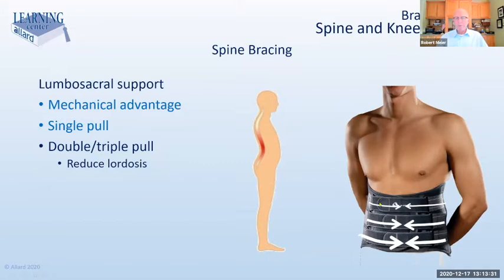Some of these have two pulls, and these are usually non-elastic straps that are pulled real tight. So some of these versions have two pulls. This one that is shown in this picture has three. By the way, I did sign a release for them to use my picture here. So I wanted you to know that I had signed that release.